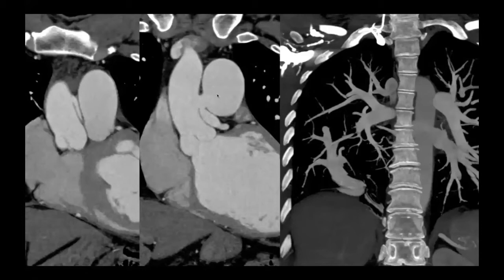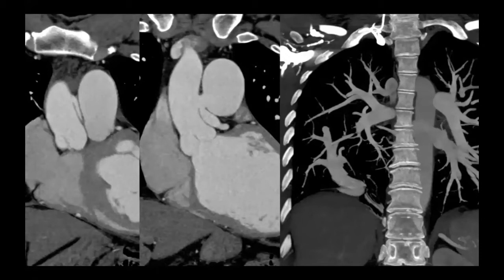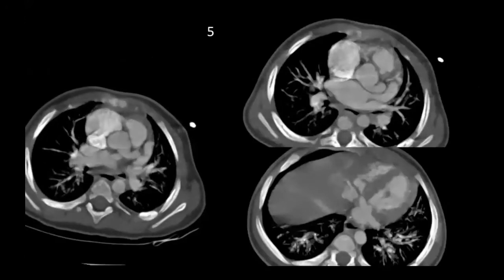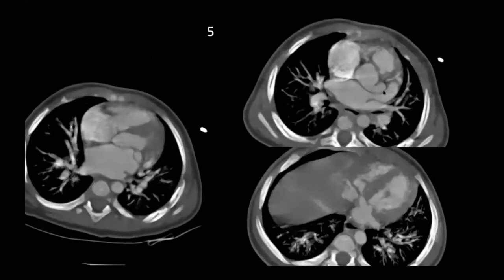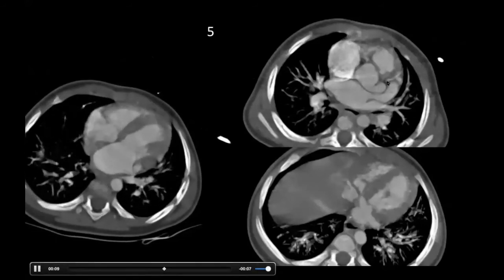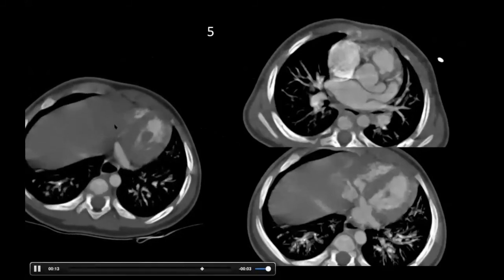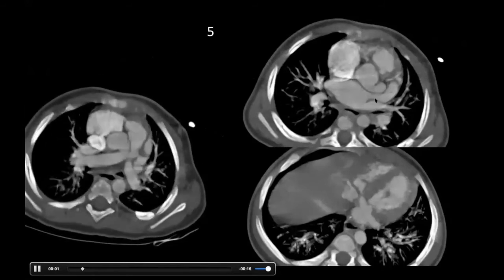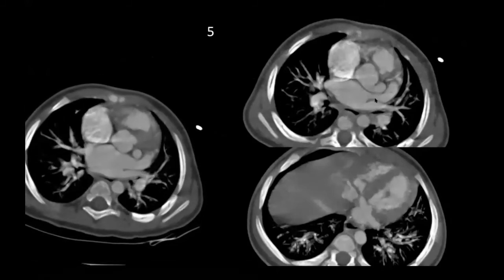This is a very unusual case: a patient with an aortopulmonary window where the left main stem is actually arising from the aortopulmonary window, while the right coronary artery arises very high from the aortic annulus with an interarterial course. Incidentally, we also come across pathologies like Scimitar syndrome — partial anomalous pulmonary venous drainage going down to the liver. Coronary artery aneurysms are also very well seen on CT; you can follow these patients up. This patient had a coronary fistula going into the right ventricle — excellent for surgical or interventional planning.